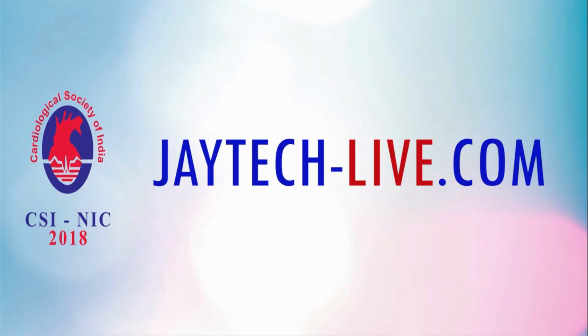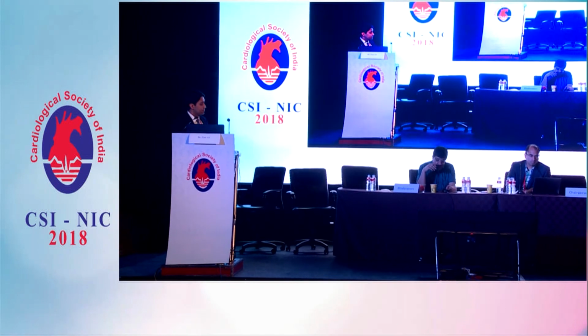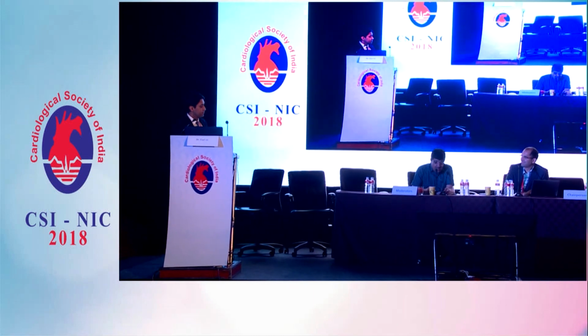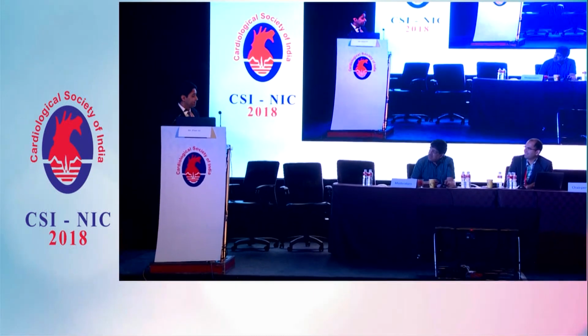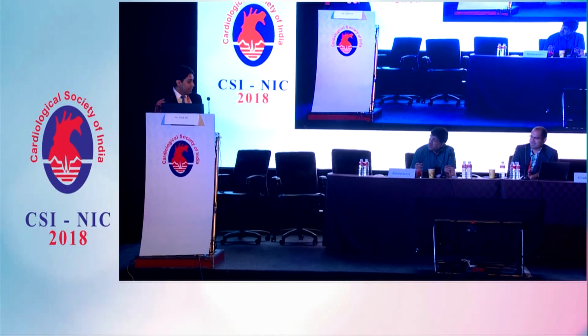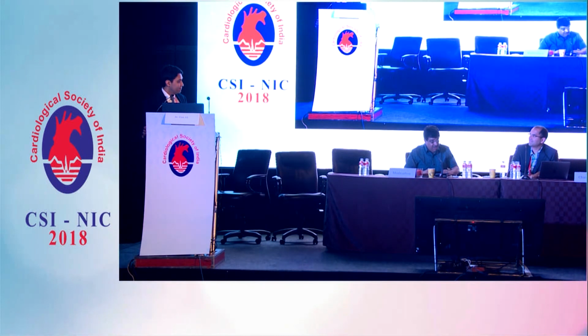Thanks very much. I won't let you go. Let me ask you a question. If I look at it, the CTOs, calcium one third, diabetes one third, ACS 25%, bifurcation again about 20-25% at least, ISR 5%. If you take them together, I think almost any patient will have one of these characteristics. So now that the contrast issue is also not there, you are showing beautiful images. Let me know which are the cases in 2018 which you can permit me to do without an OCT, cost not being in consideration.